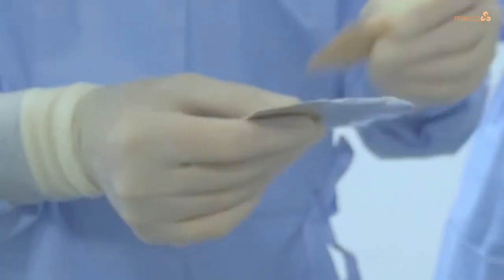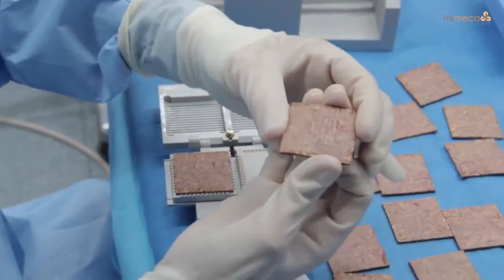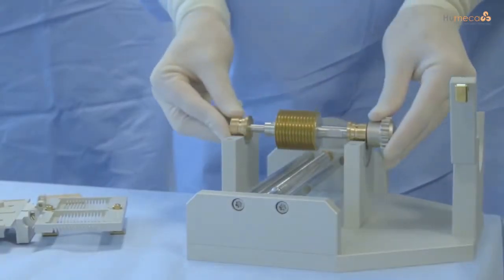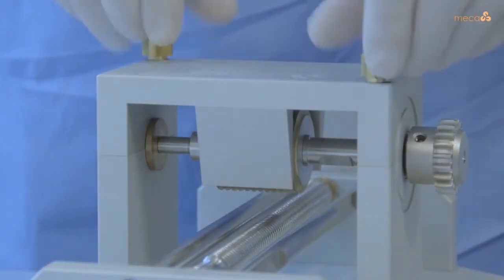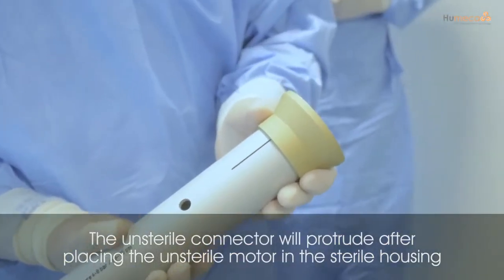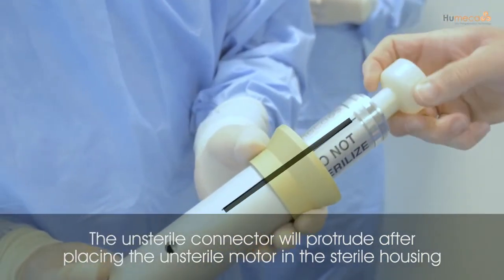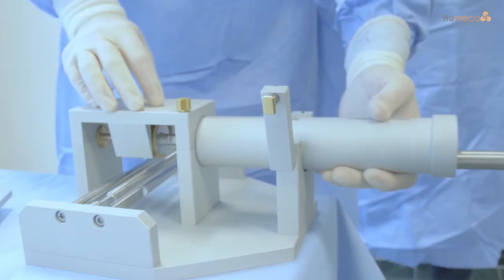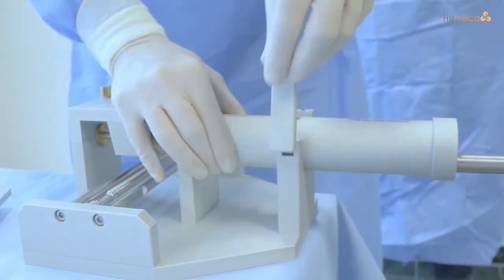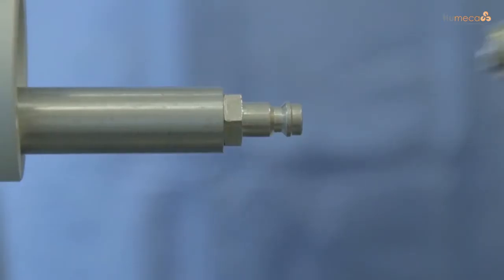In the following sequences we will present the surgical instruction procedure of this modified Meek technique. The blade axis is put down on the Meek machine, the bridge is placed over it and tightly secured. The unsterile motor should be encapsulated in the sterile housing by using the sterile funnel and the black lines as guidelines. After sliding the motor into the housing, it is placed on the machine and secured with a clamp. The hose of the air supply is connected to the connector of the motor by means of a quick coupling.